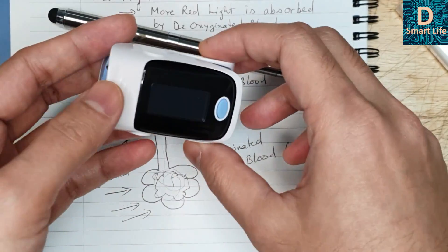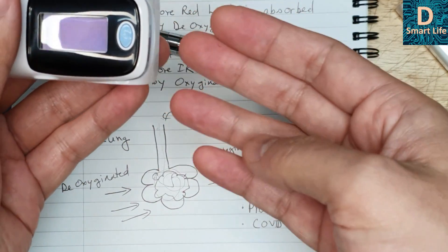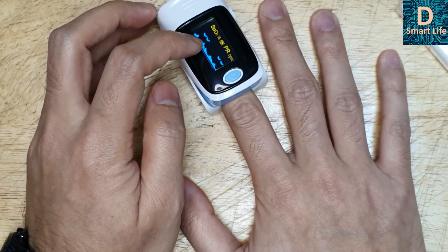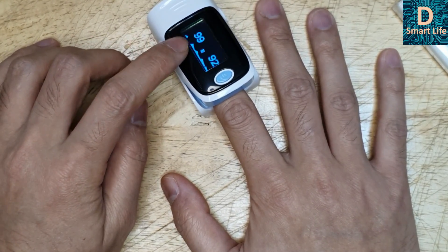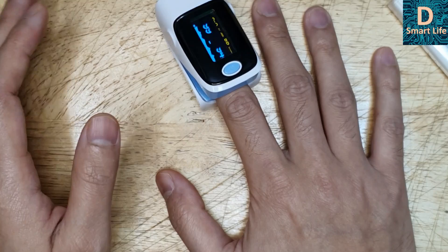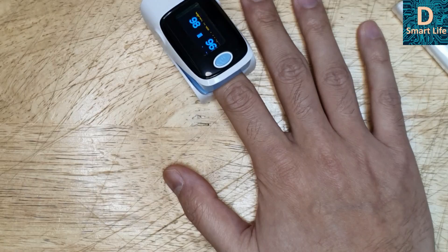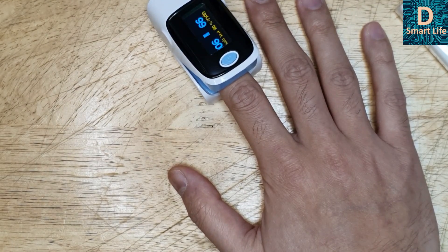Another thing — these are probably Chinese-made, cheap products, and how do we know they are actually working? So I've devised a test. This device is supposed to measure blood oxygen saturation. What I'll do is breathe into a polythene bag for some time. If I restrict fresh air intake, this level should decrease. If the numbers go down, we can say the device is actually working. But it takes time to reflect in the numbers, so I need to do this for quite a long time.